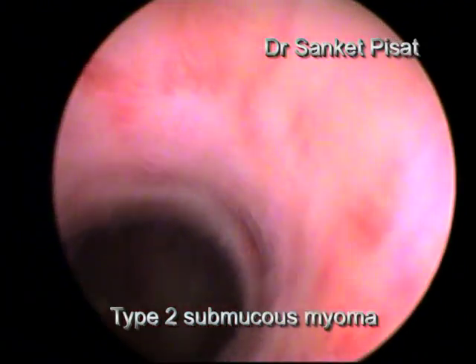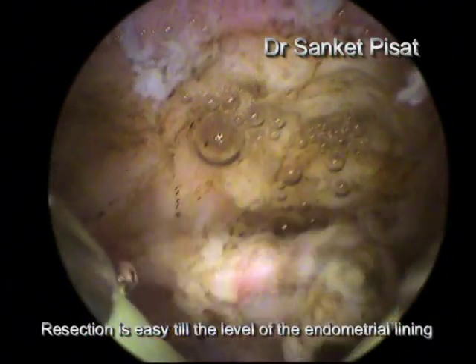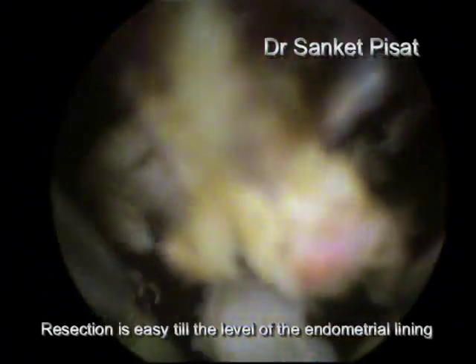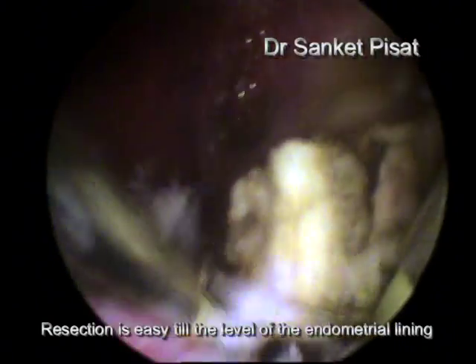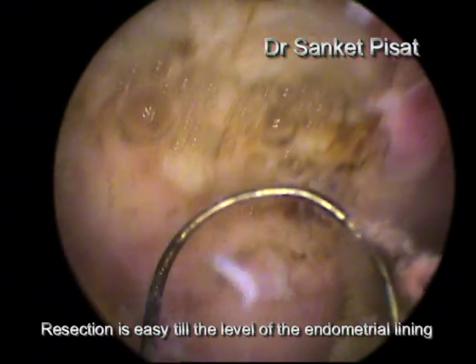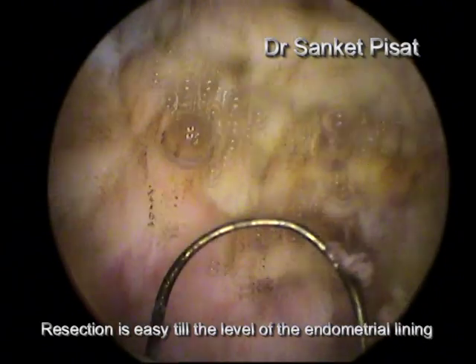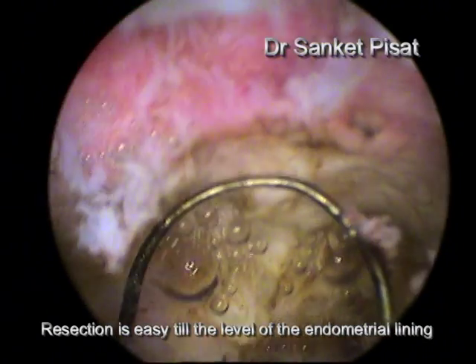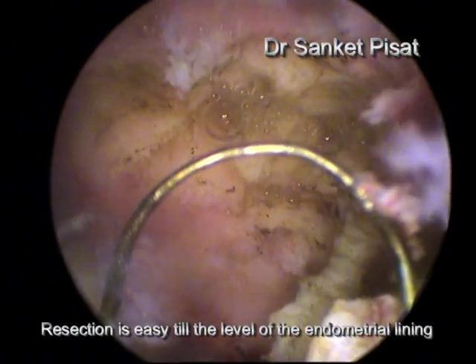Resection is started and is easily carried out up till the level of the endometrial lining. However, at the level where the fibroid is flush to the endometrial lining, the surgeon is faced with the dilemma of either cutting into the myometrium to scrape out the fibroid, thereby risking a perforation, versus leaving a part of the fibroid behind.